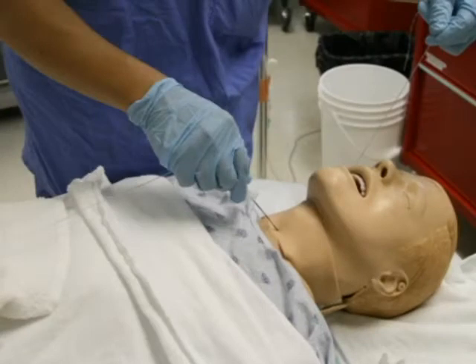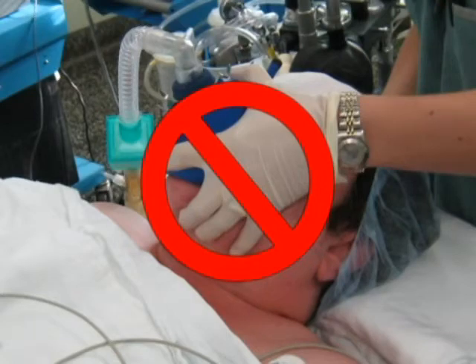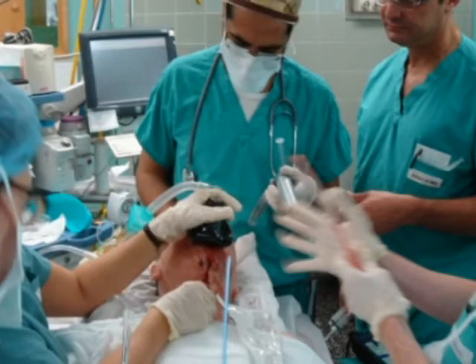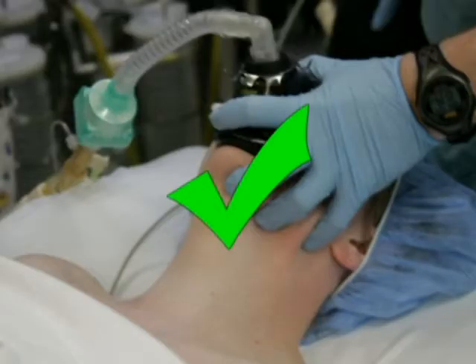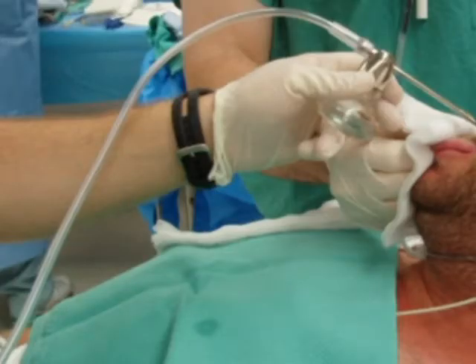While retrograde intubation is not often considered to be a technique of choice in cannot intubate, cannot ventilate situations, it remains a useful technique, particularly in patients with a predicted difficult airway, or in a cannot intubate, can ventilate, failed airway. The technique can be performed either under general anesthesia or awake with skin infiltration and topical anesthesia.